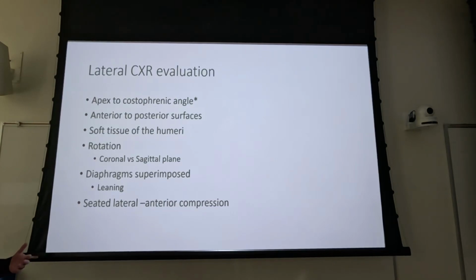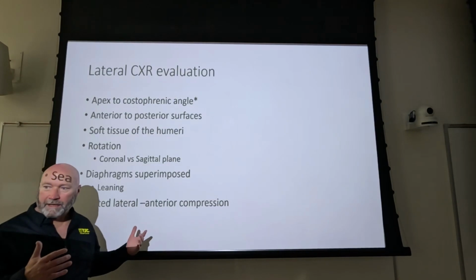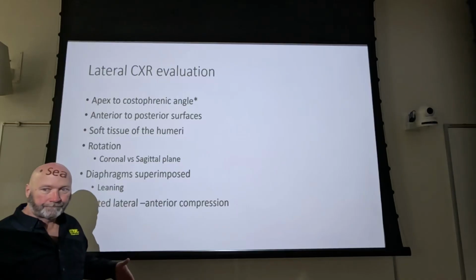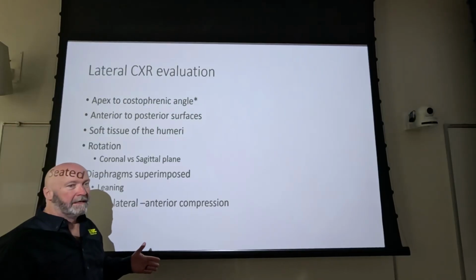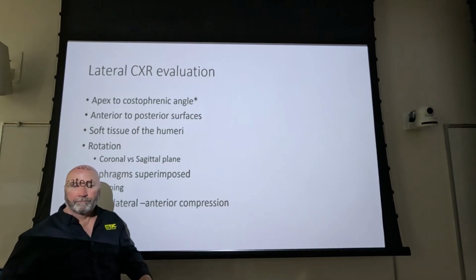If you have somebody who's got wide hips and narrow shoulders, and you tell them to put their side up against the Bucky, their hip hits the bottom of the Bucky and they have a tendency to lean into it. Somebody with broad shoulders and narrow hips goes the opposite direction. They want to put their hips up against it and they lean away from it.